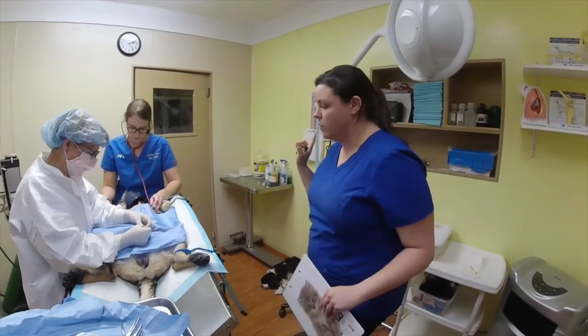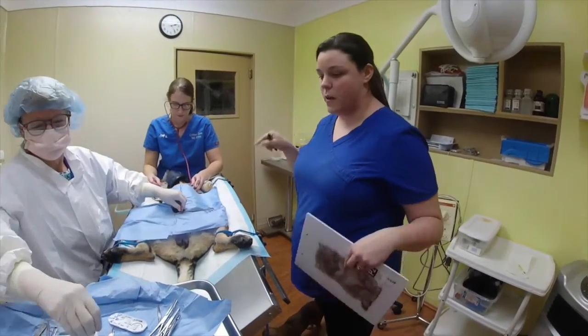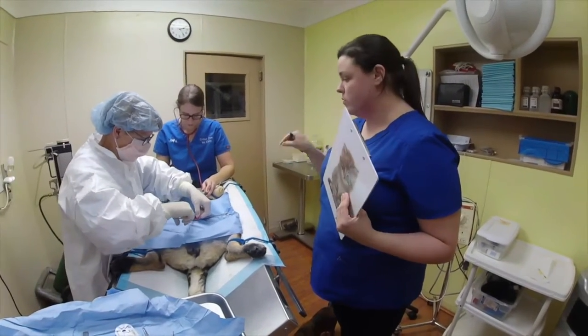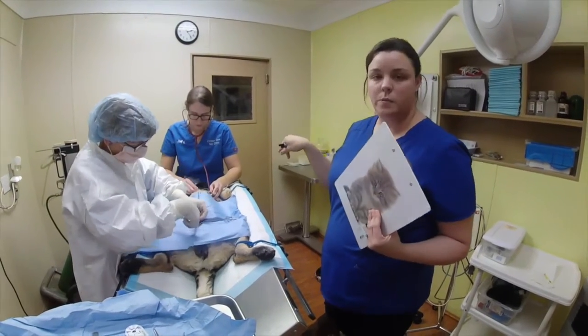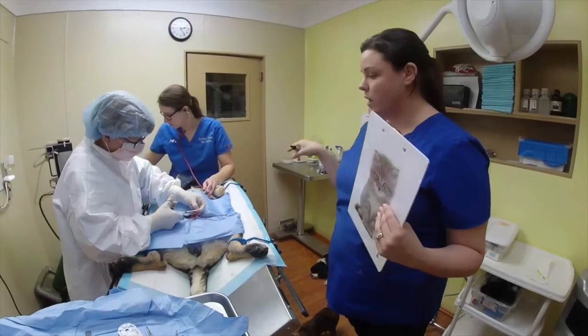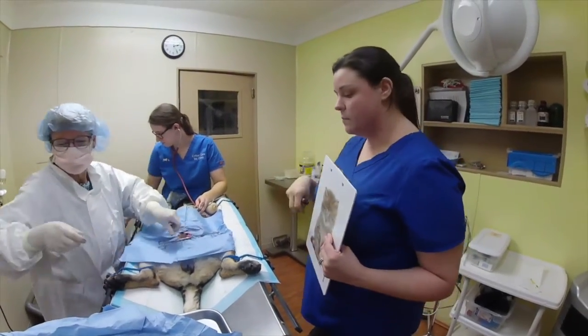Okay, I'm here with my preceptor, Jessica, and Dr. Lindley. She's doing a spay on a dog. We are monitoring her vitals. We have direct contact, and we have her ECG monitor and SpO2 monitor on her. We're going to check her vitals every 5 minutes and her temperature every 15 minutes.